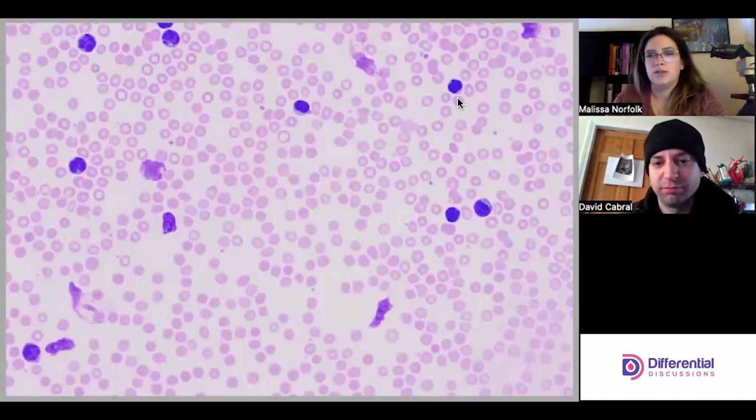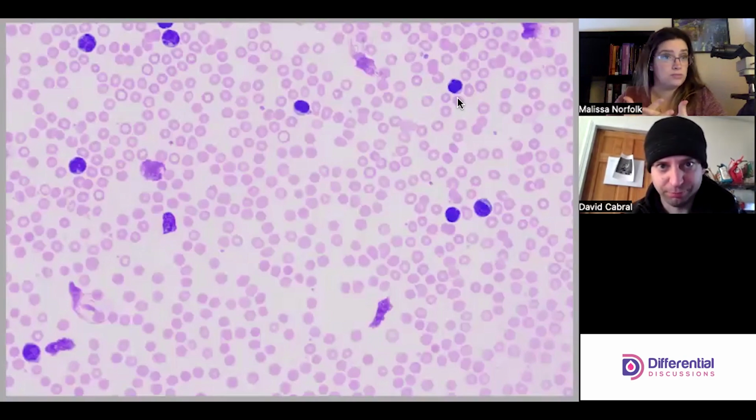And then, this is where you're going to do your white cell estimate if you're doing one, and just that kind of stuff. And so we're just kind of glancing and saying, oh, look, I already know there's smudge cells here. I already see that this is a very monotonous picture. So I already know what to expect now in greater detail. Yep. And now let's drop down to 100. Cool.